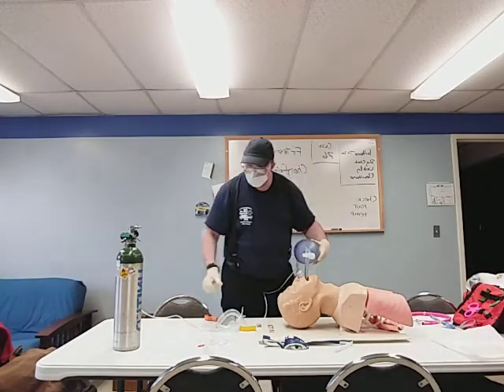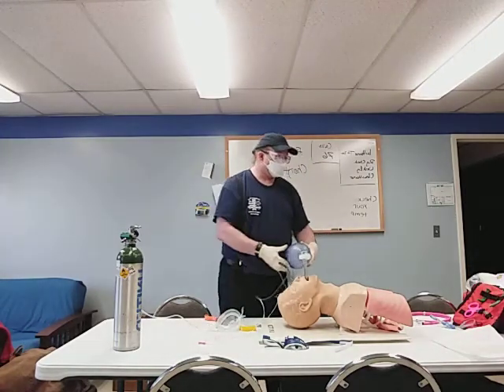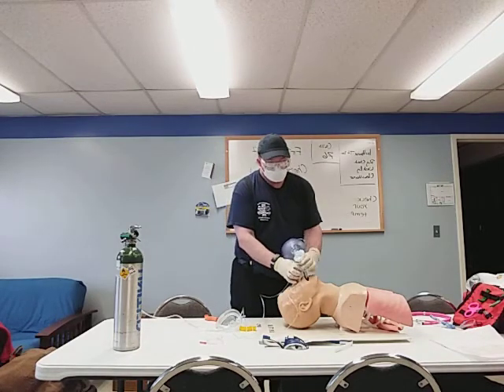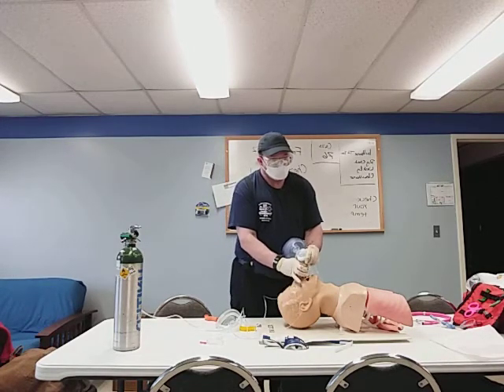So at this point, the next step is to verify proper placement and effective ventilation with capnography.